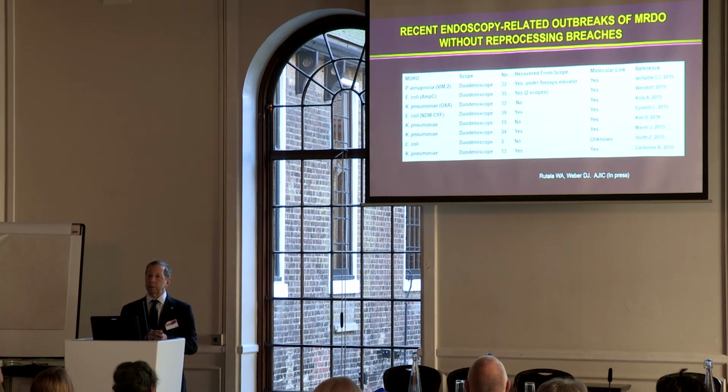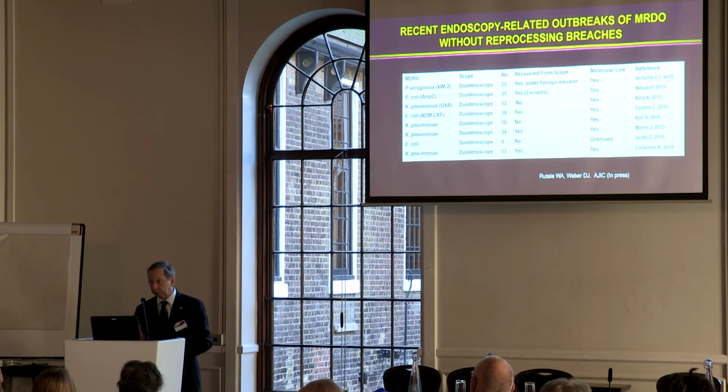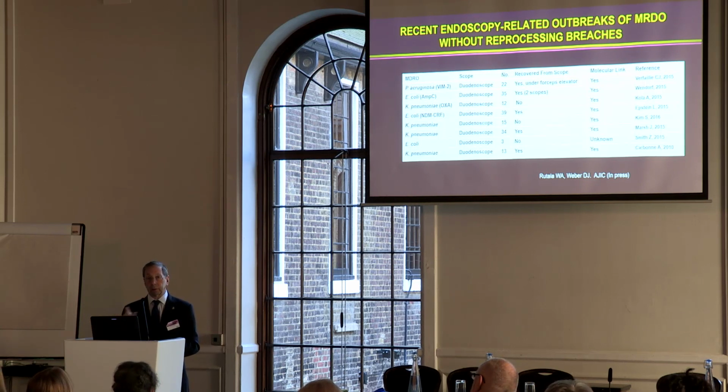Most of the previous outbreaks were related to either inappropriate or inadequate cleaning or a problem in doing disinfection: not brushing the scope, not connecting the scope in an automatic endoscope reprocessor to the flow, so there was no disinfectant flowing in it, or diluted disinfectants that were below the use concentration. But here we now have a number of outbreaks in which, as reported, everything was done correctly. Cleaning was correct, and all the reprocessing was correct.